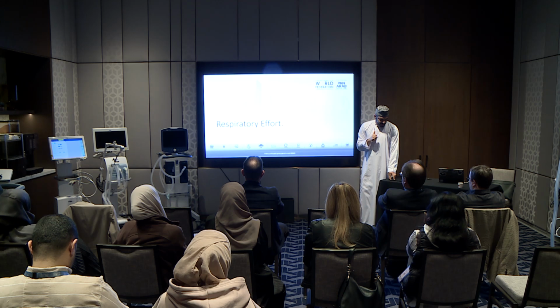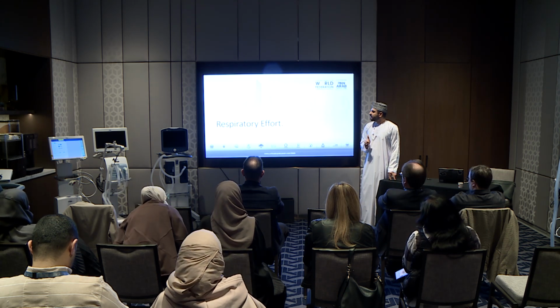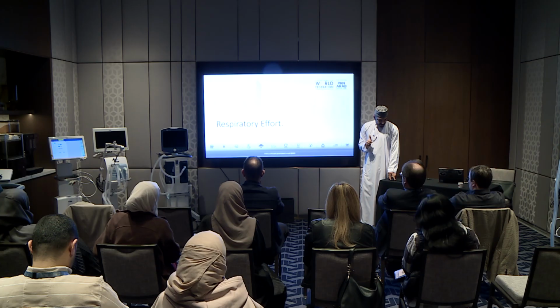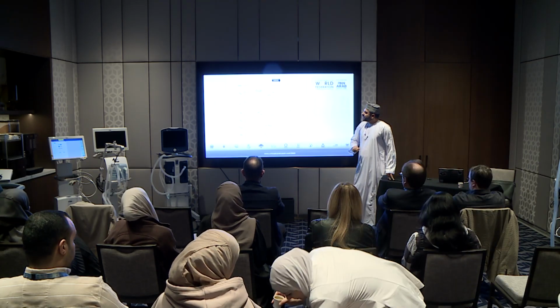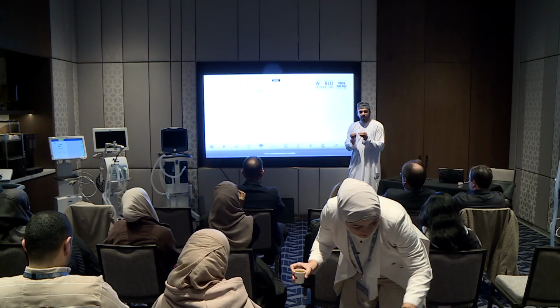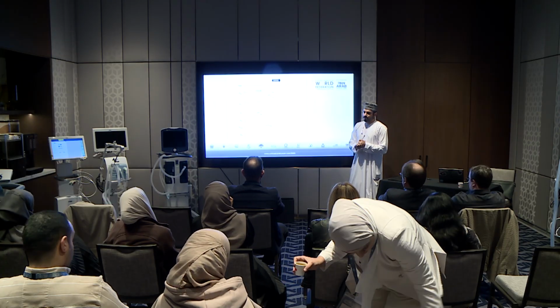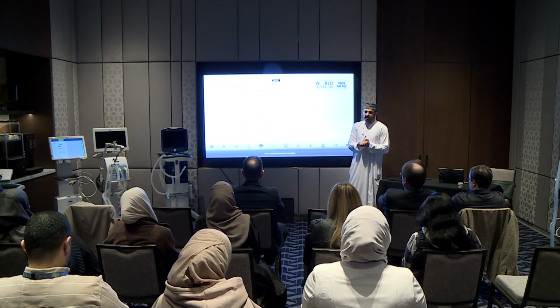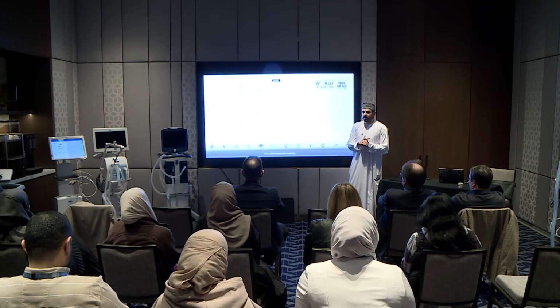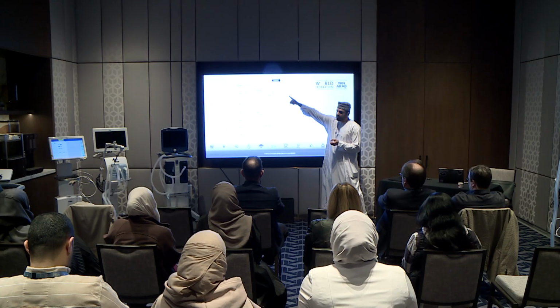Now, when we go to the respiratory effort, there is another measurement for the respiratory effort, and the measurement that we use here is the occlusion pressure, or Pocc. So Pocc is a maneuver that you perform. The machine does not do it automatically for you. Basically, what you do in the Pocc is an end-expiratory hold. In the study, they used 5 seconds. And then you see what the pressure is.